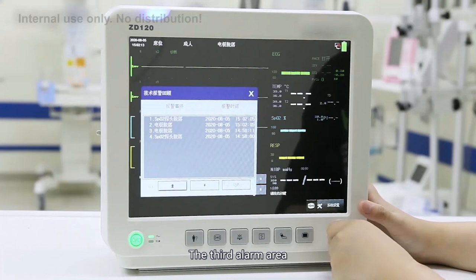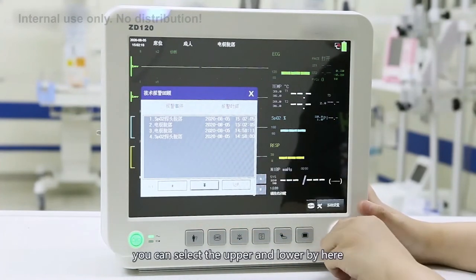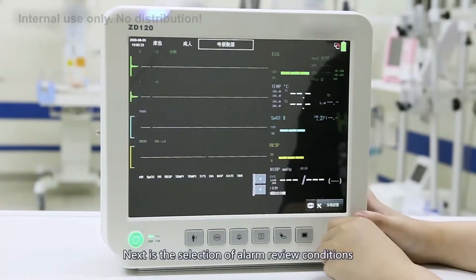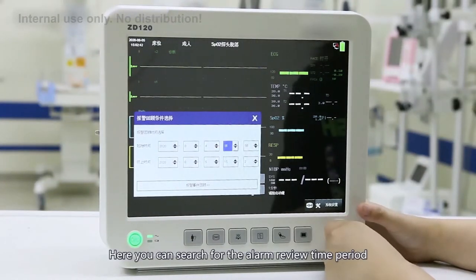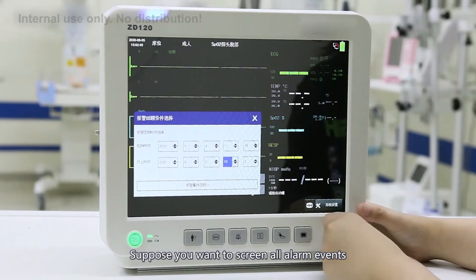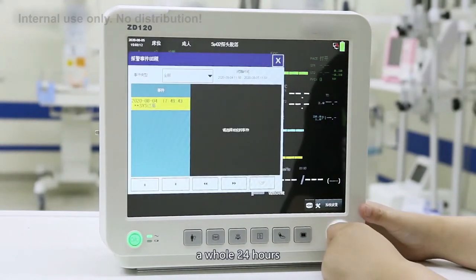The third area is the alarm area, which displays alarm events within a selected time period. You can select the upper and lower range here, and choose alarm review conditions to search within a specific time period. For example, you can screen all alarm events from 11 yesterday to 11 today — a full 24 hours.